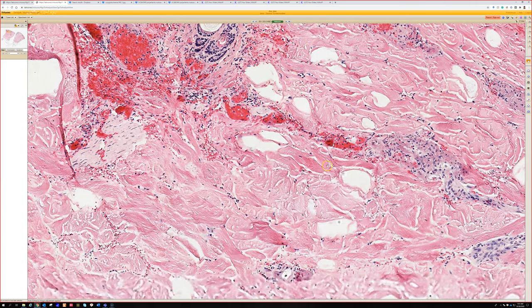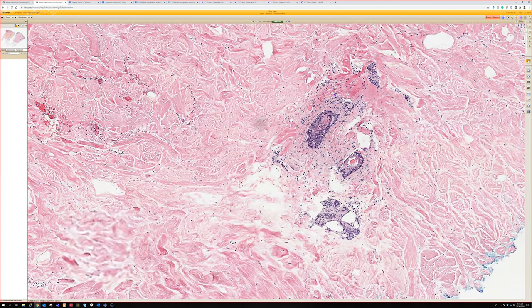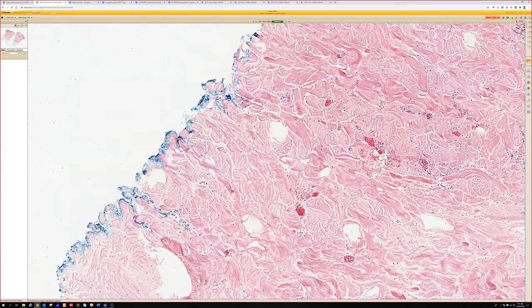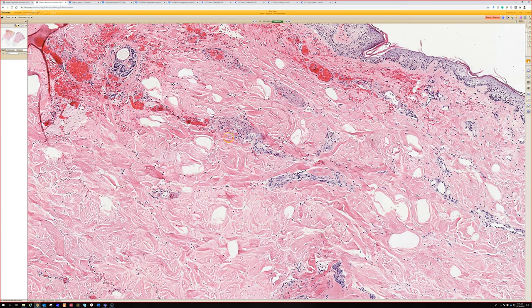One of the greatest signs of acute ischemia is the necrotic eccrine coils. Anytime you see that, you've got to figure out why. Is it thrombotic vasculopathy from DIC or systemic coagulopathy? Is it an embolus? Is it calciphylaxis? Is it angioinvasive fungus? Once I see this, I have to figure out why it's happening because most of those things are potentially medical emergencies.